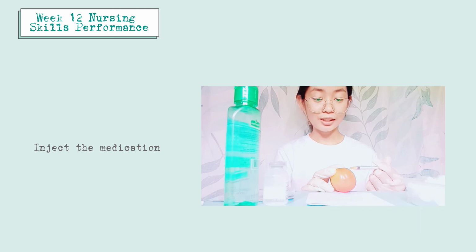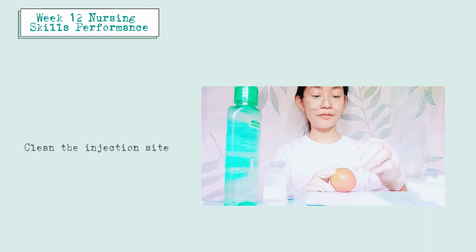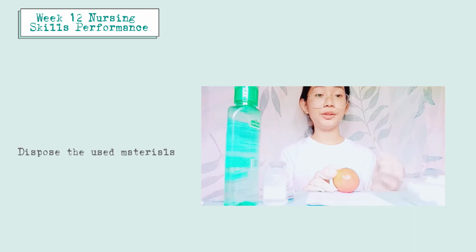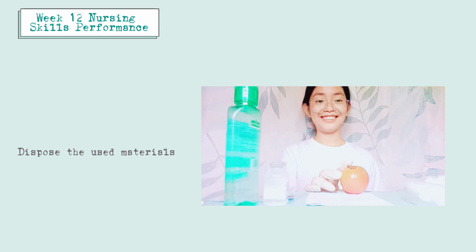After that, slowly withdraw the syringe at the same angle of insertion. Then clean the injection site for the last time using a dry cotton swab and discard. Also, dispose of this used syringe in the sharps container. And that's it.